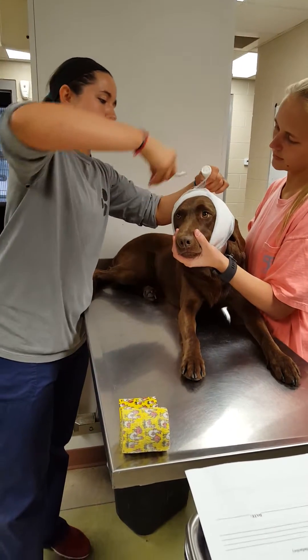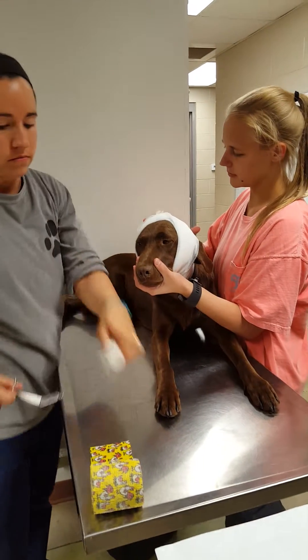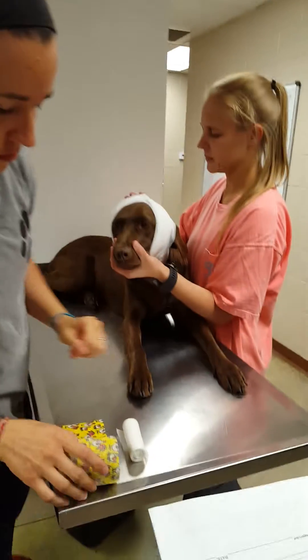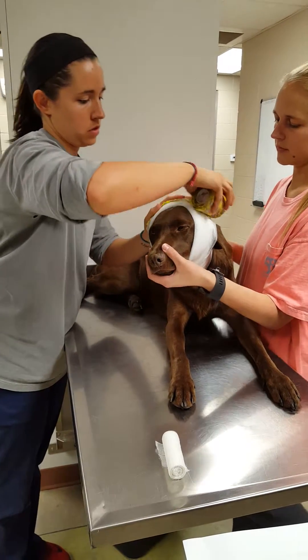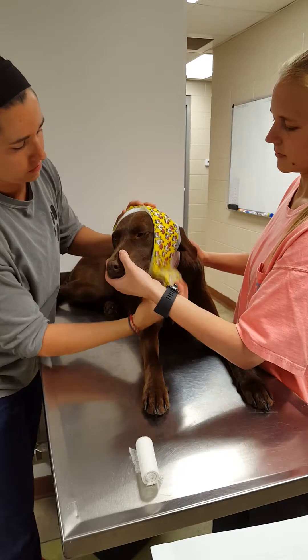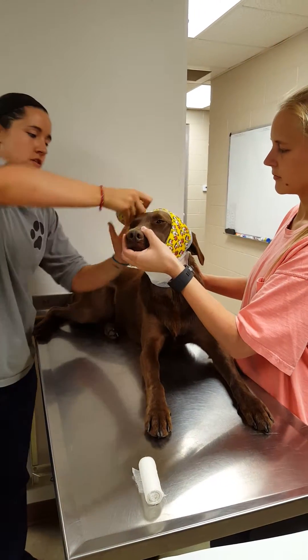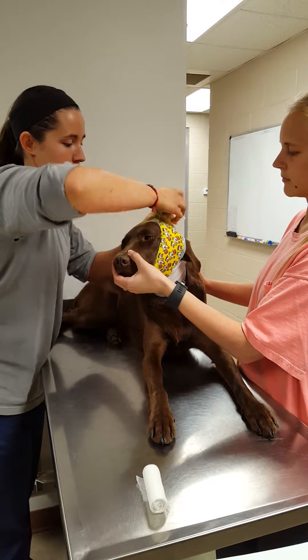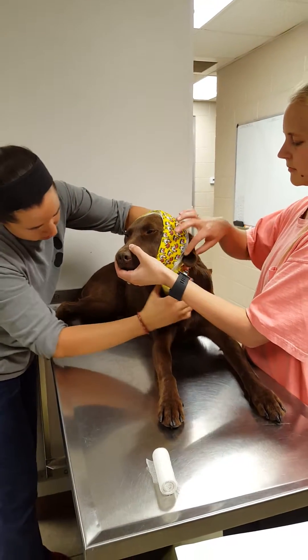I'll take some bandage scissors and just cut that right there and finish with my vet wrap. Start going the same direction, do the same thing. I'd already unrolled this vet wrap and re-rolled it so it's nice and loose — I don't have to worry about it being too tight around her throat.